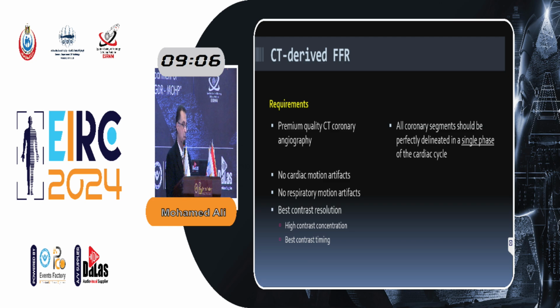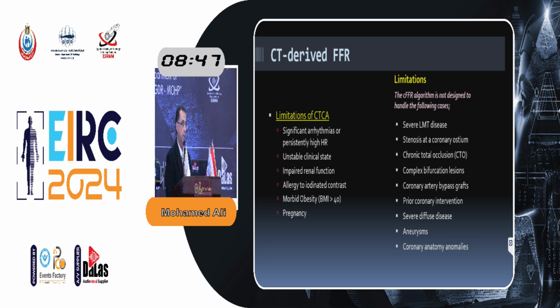CT-derived FFR requires premium quality CT coronary angiography to be processed, with no cardiac motion artifacts, no respiratory motion artifacts, and the best contrast resolution. It also requires that all coronary segments be perfectly delineated in a single phase of the cardiac cycle.